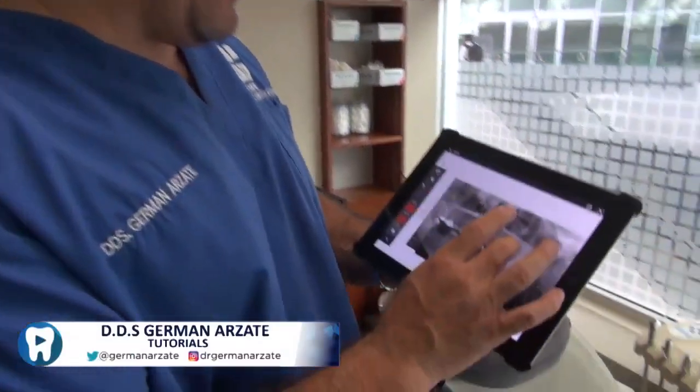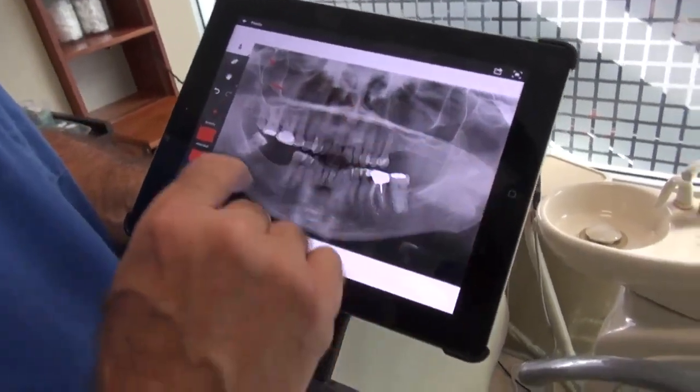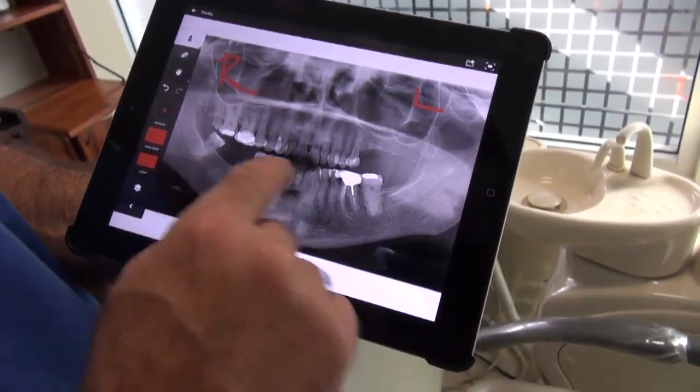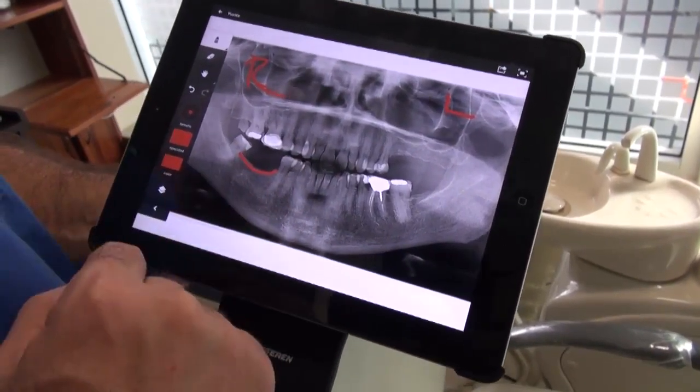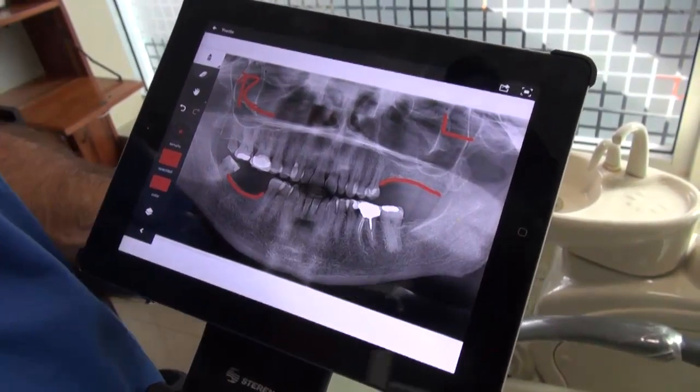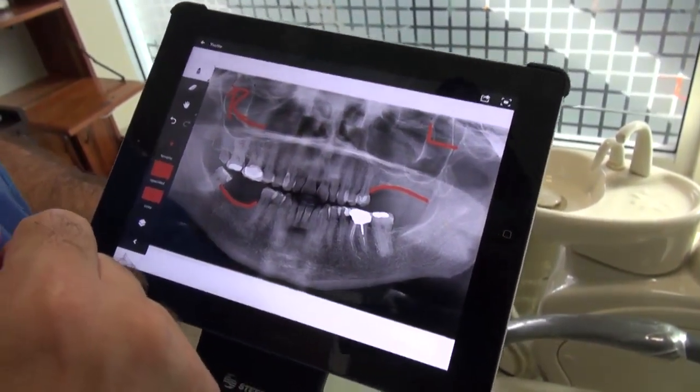If you have a patient that has no molars, we need to have a good view of this. This is right and this is left, uppers and lowers. We don't have molars on lower right and we don't have molars on upper left. So the patient is requesting implants.